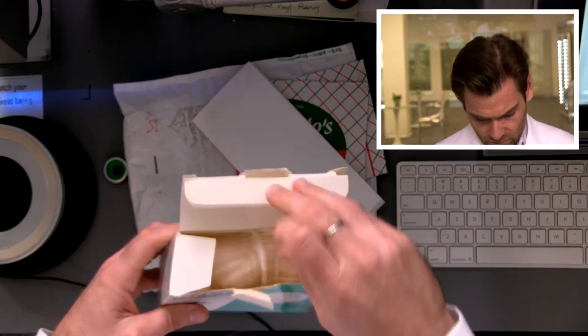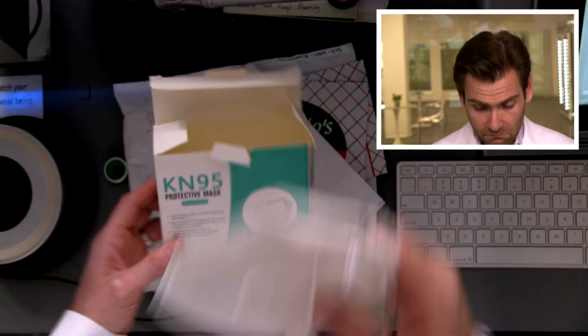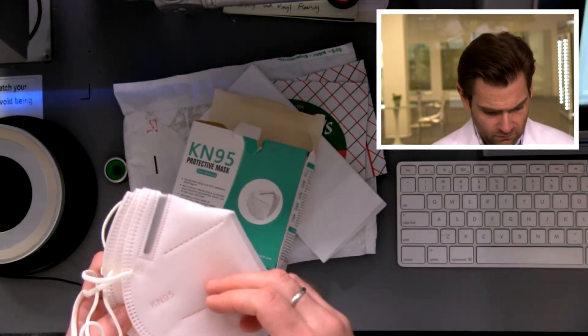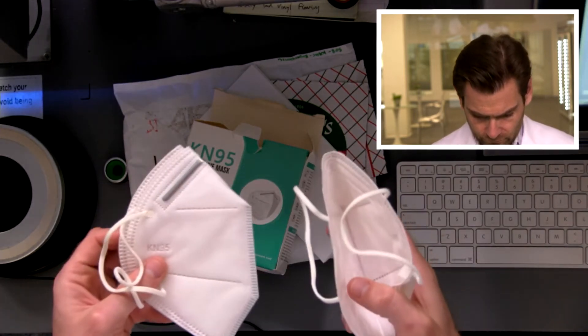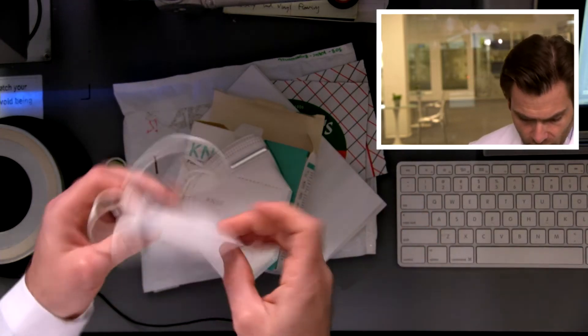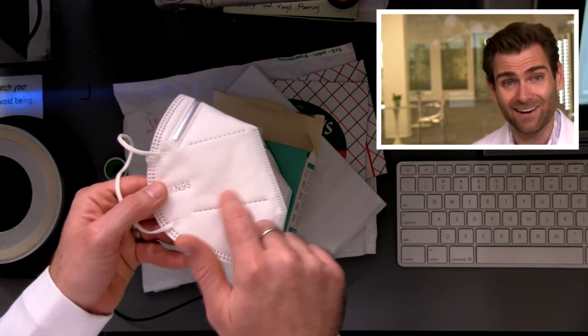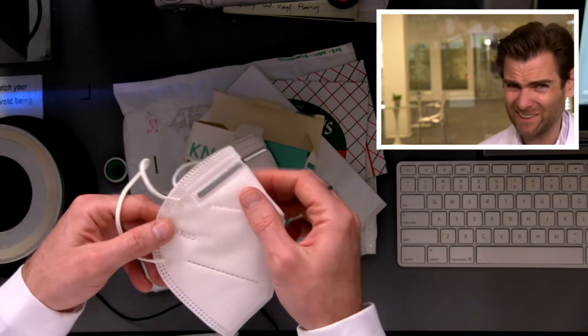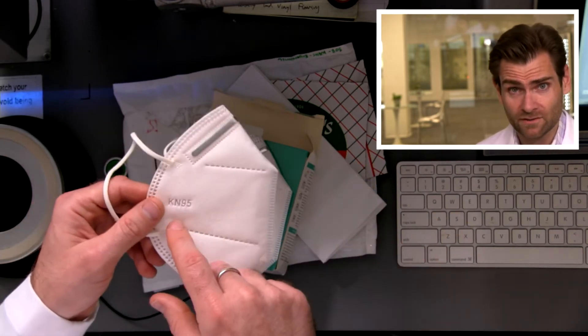Made in China. These are just flopping around in here — there's no quality certificate. Part of the GB 2626 standard is that you actually state that on the mask itself. The fact that it doesn't say that on there leads me to believe this is probably a fake. It just says KN95.